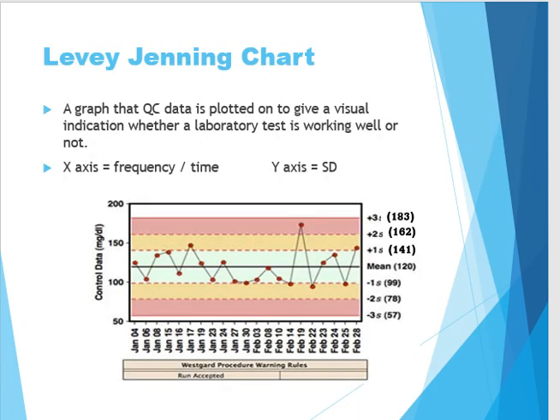Okay, the second way is to use the Levey-Jennings chart. It is a graph on which the QC data is plotted to give a visual indication of whether a lab test is working well or not.